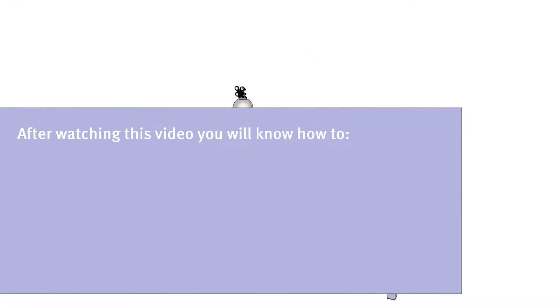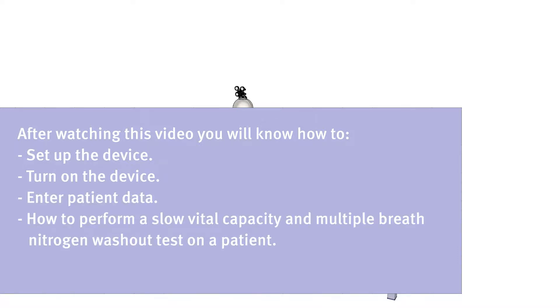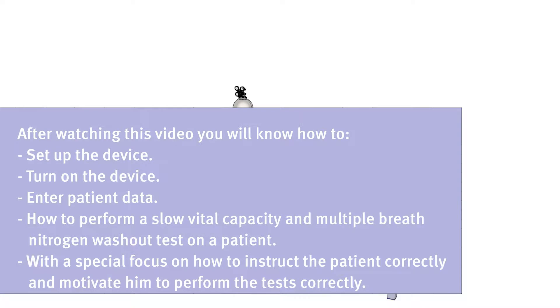After watching this video, you will know how to set up the device, turn on the device, enter patient data, and how to perform a slow vital capacity and multiple breath nitrogen washout test on a patient, with a special focus on how to instruct the patient correctly and motivate him to perform the tests correctly.